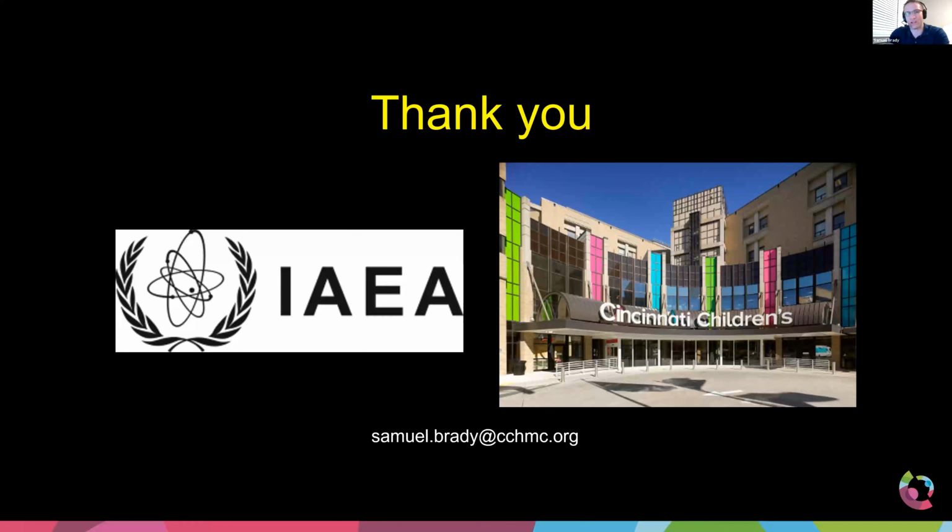The areas where you can get into a lot of trouble are doing a lot of cine runs or DSAs, obviously, because you acquire the image for the mask, and then you acquire the image when you inject the contrast to do the subtraction. These tend to be a little bit higher dose values, so you're basically acquiring two images to do one thing, and they're a little bit higher dose so that the noise is lower, and so those can be kind of high dose. But like I said, if you're not crossing that threshold, I wouldn't worry about doing the skin dose calculations.